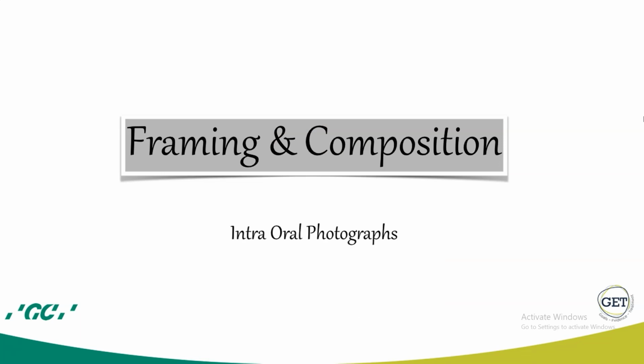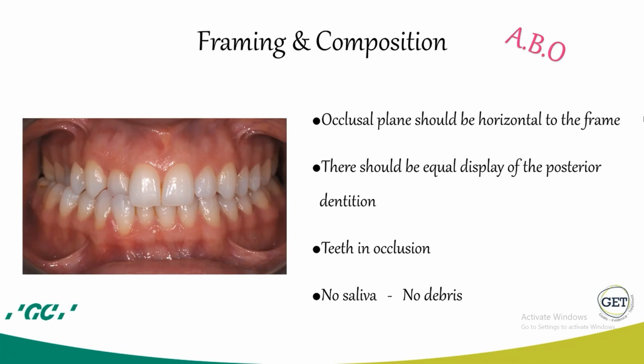Framing and composition for intraoral photographs. According to the guidelines of American Board of Orthodontics, the occlusal plane should be horizontal to the frame. There should be equal display of the posterior dentition on right and left sides. Teeth should be in occlusion, and we should be very careful about saliva and debris.